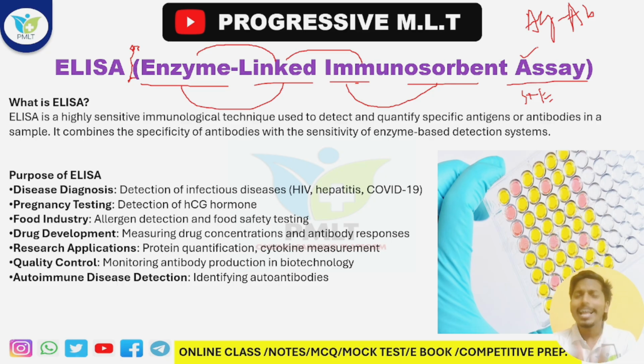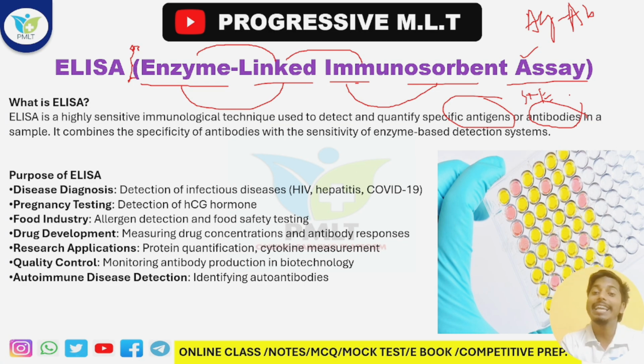So ELISA basically helps to detect the antigen or antibody. You can easily detect the antigen as well as the antibody. You don't need to memorize this, just take the concept and move on. We can do ELISA for detecting antigen, and not only antigen but also antibody. That depends on what we have to detect.